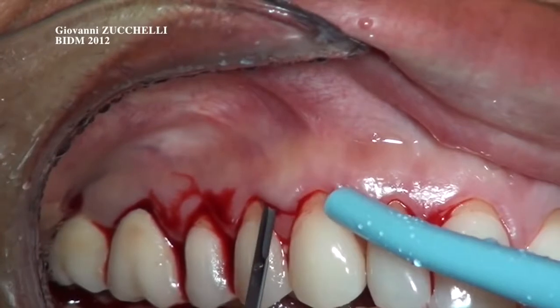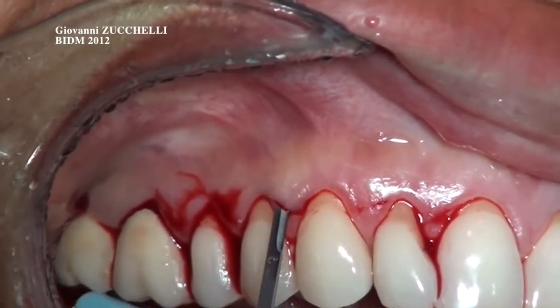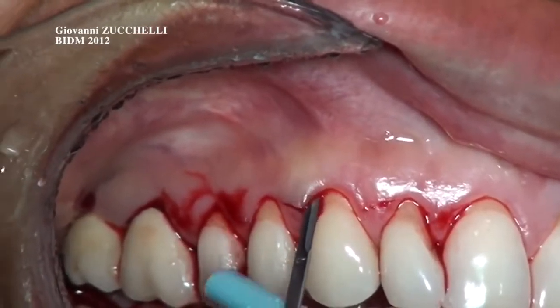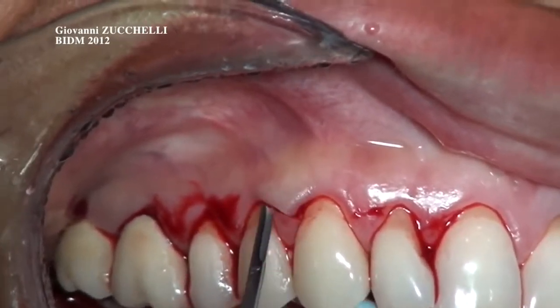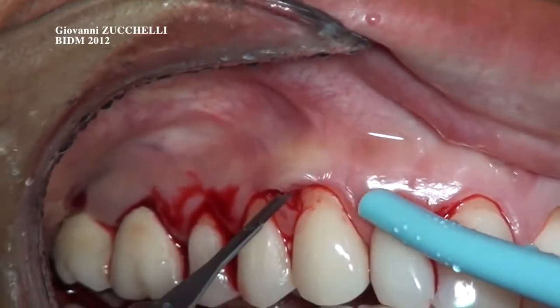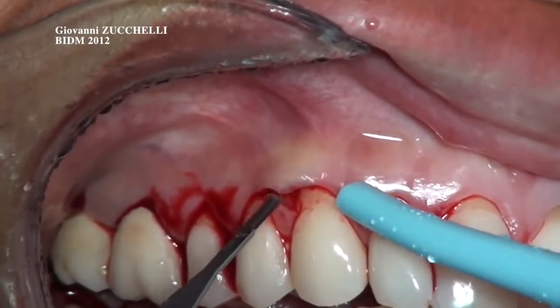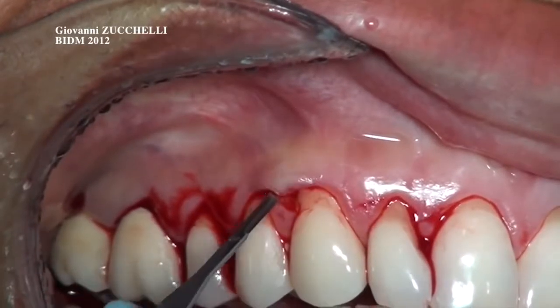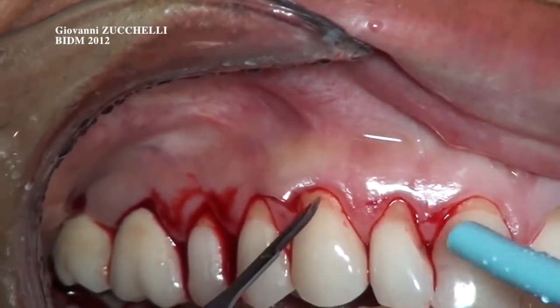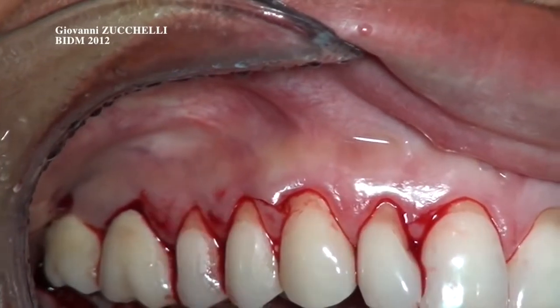Namely, if you look at the inclination of my knife, it's almost parallel to the soft tissue, and once the entire papilla has been dissected, the buccal keratinized tissue becomes mobile due to the presence of the probing pocket there.